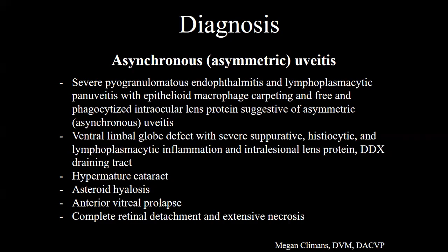Lesion is somewhat common for asynchronous uveitis. Yeah, there are cases, I didn't really focus on the retina, but it did get pretty necrotic too. And yeah, you can get really severe uveal necrosis. And as Kelsey points out, sometimes limbal scleral necrosis like this in cases. We do tend to get more severe in diabetic cases. Mm-hmm. But yeah, it's not uncommon to see that limbal sclera lesion in particular in these really severe lens-induced uveitis cases.